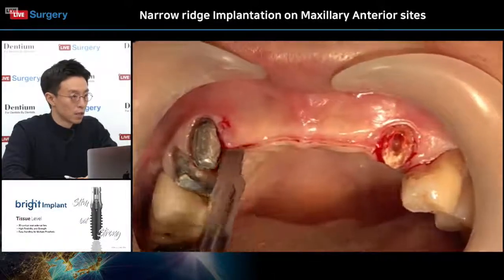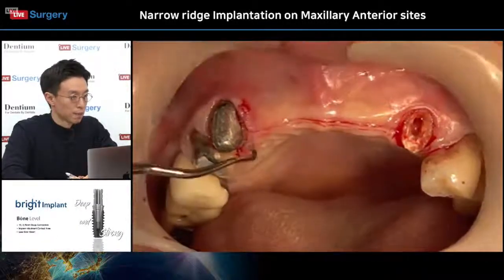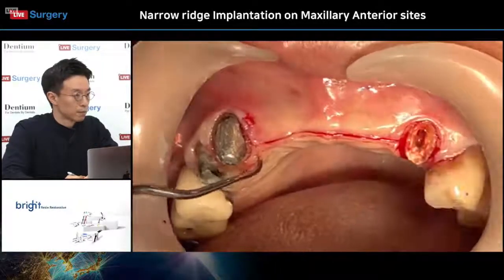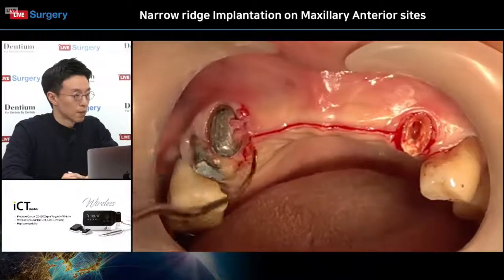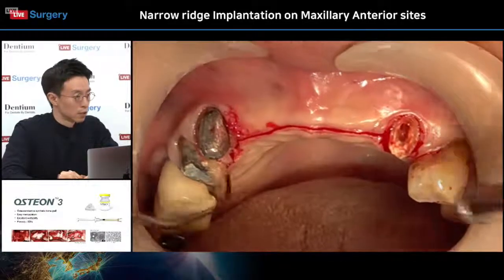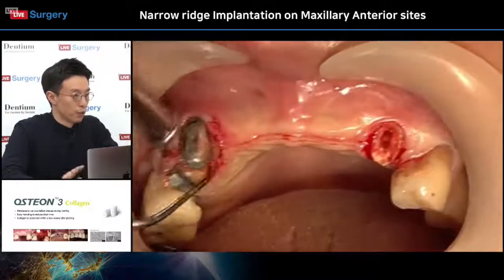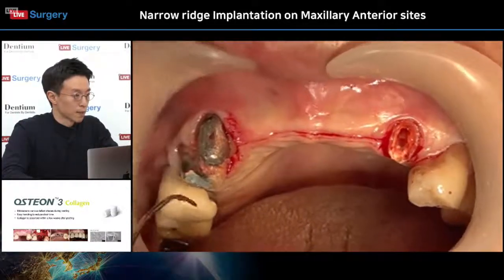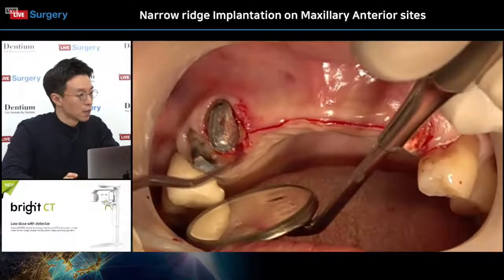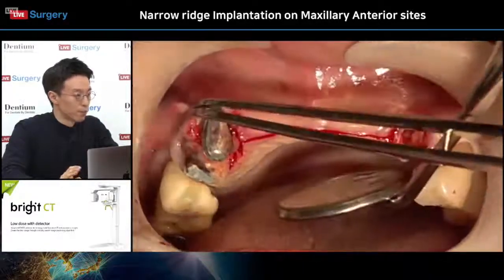Is cutting the periosteum definitely. Dr. Chung did 2 circular incisions at both adjacent teeth. I guess he is trying to remove the periodontal pocket.